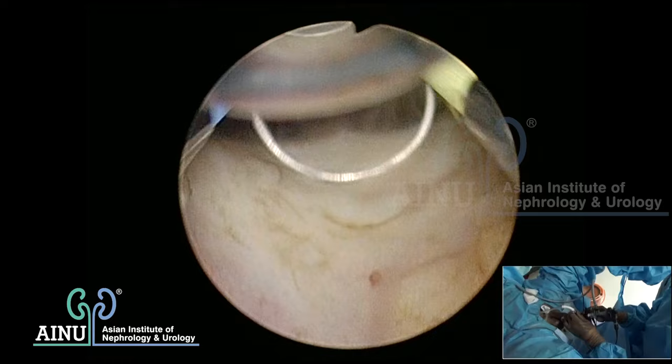Toileting makes the prostatic fossa very smooth and clean and allows assessment of hemostasis. The capsular tissue is already exposed. I can see adenomatous tissue and I'm excising it. You'll see movement inside the capsular area when moving the scope - don't cut any further as that movement itself will cause capsular contraction and perforation. This is the capsule where you see arborization of blood vessels - horizontal vessels placed under it. This small tissue just above the bladder neck is being excised to better expose the peripheral zone of the prostate.